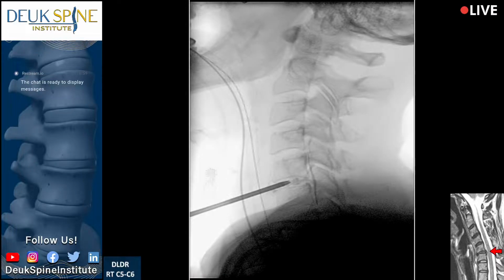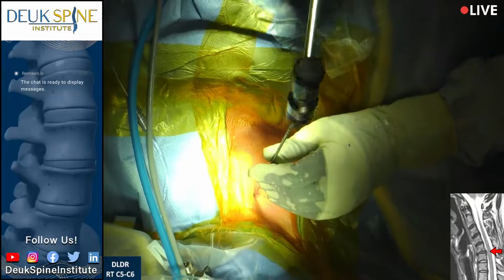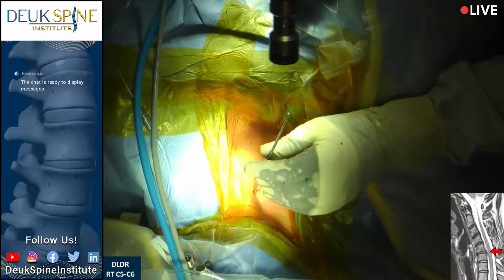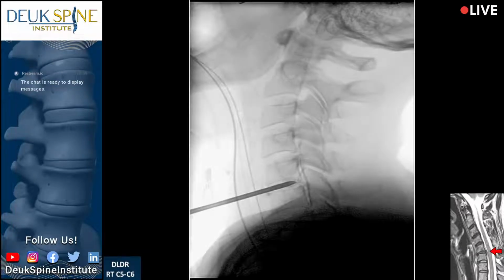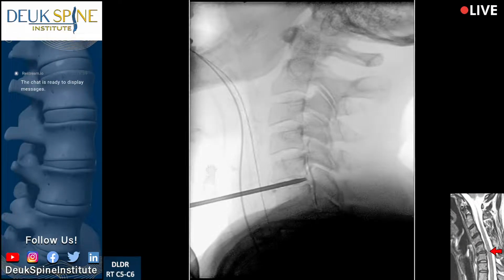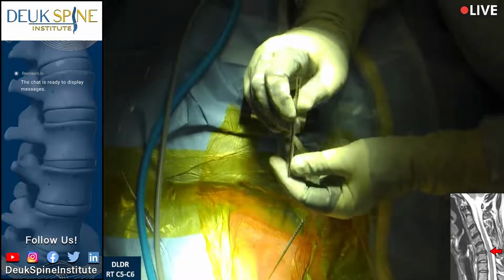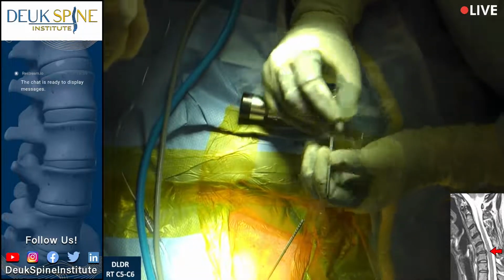Shot. You can still see the tear. See it there? Shot. There we go. We're right inside the tear now. The dilator is now at the back of the disc where the herniation and tear are. And now I'm going to show you what we're going to do the whole surgery through, this tiny little tube right here. Can you guys see this tube? Yep. It's like a metal straw.